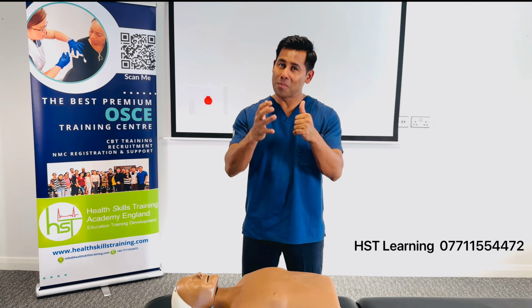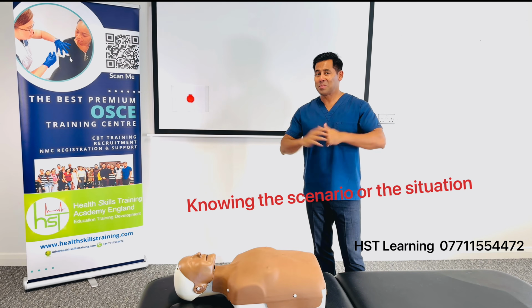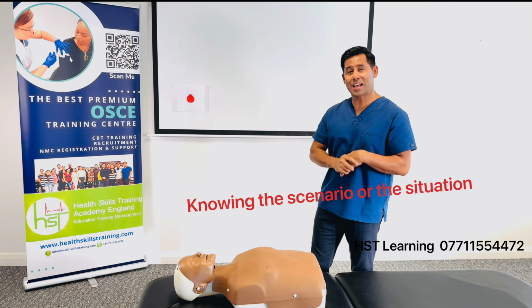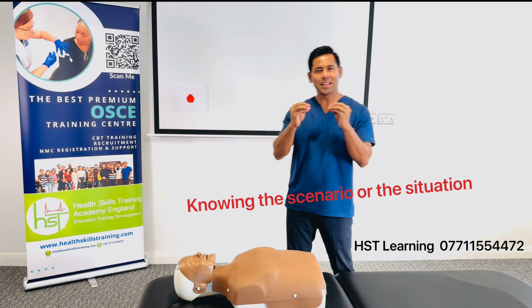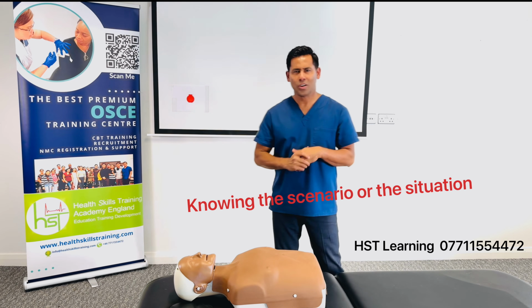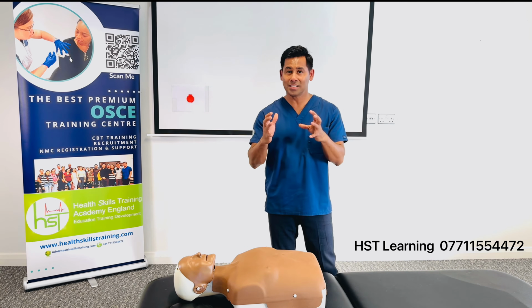Let's look at the common errors that you see in in-hospital resuscitation. Number one common error people look for is, do I get a scenario in this station? Is the examiner going to tell me what type of patient I am going to get? Simple thing is, you have a dummy there and you know that it's a resuscitation station. Whether you have a scenario or not, whether you know the patient name or not, it is an emergency situation.